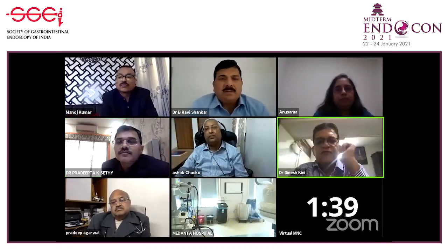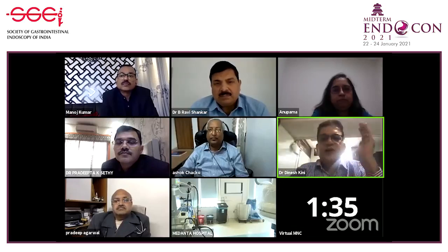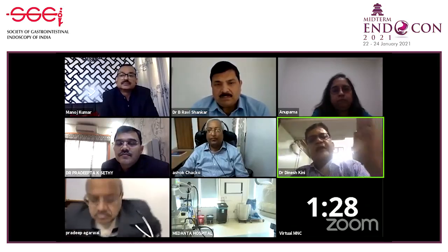This is Dr. Dinesh Kini from Bangalore. In a clinical situation where somebody comes with an overt bleed, not an occult bleed, and endoscopies are normal, do you think a CT and an enteroscopy give more value than doing a capsule endoscopy? This is compared to somebody whose hemoglobin drops, endoscopies are normal and CT is normal. In those groups, a capsule is likely to yield more results than subjecting them to enteroscopy. What are your views and experience on that?